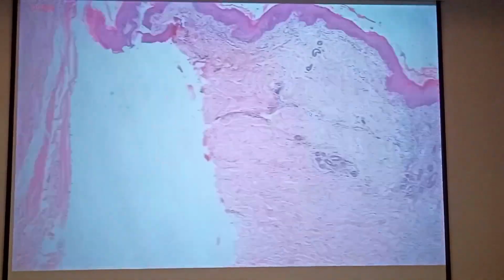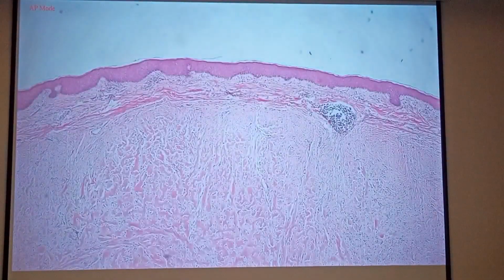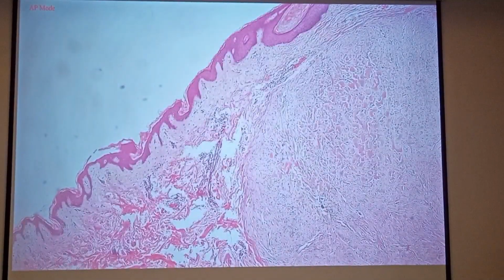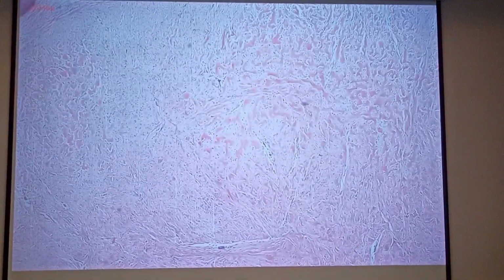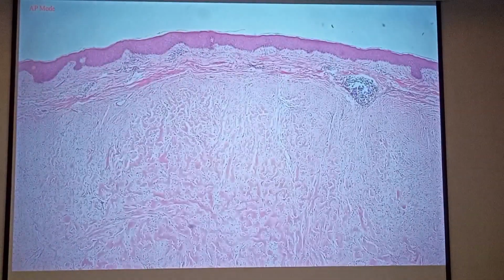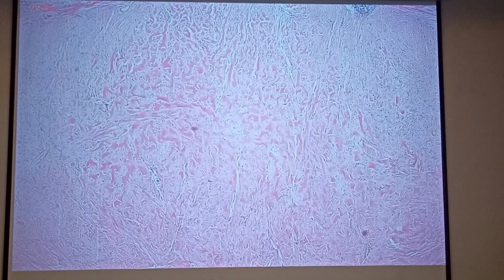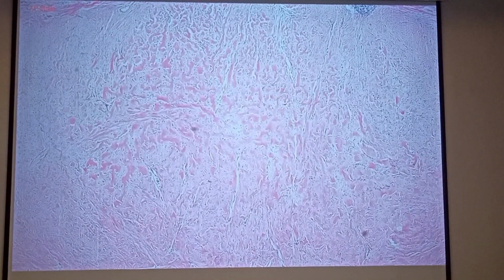However, there are also instances where there is this. Okay? There is protrusion of the scar tissue on top of a normal layer. So this protrusion is covered by the same epithelium. However, if you look beneath, you can see these thick bundles of poorly organized collagen fibers.